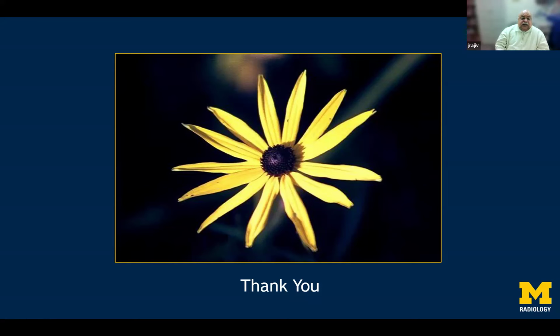And I think anybody who was trained in PGI at my time, even Ishwar, would do the same thing because that was the way it was done. And we did it on a Siemens. It was not even a helical scanner at that time. So we just used the third generation scanner to develop this sort of methodology. And I've been following it now for 30 years, 40 years.